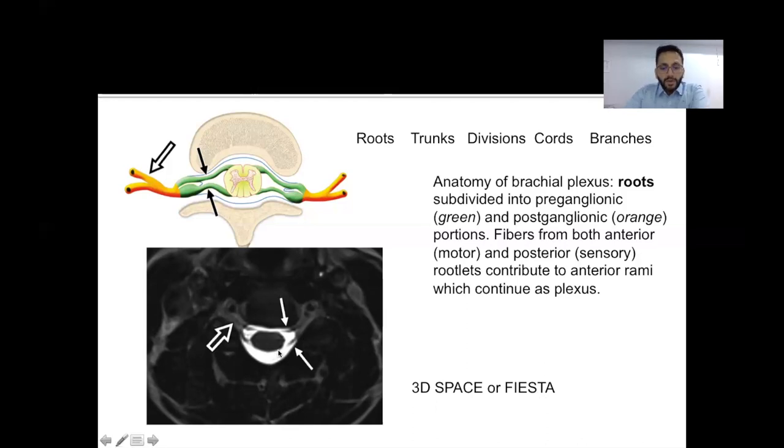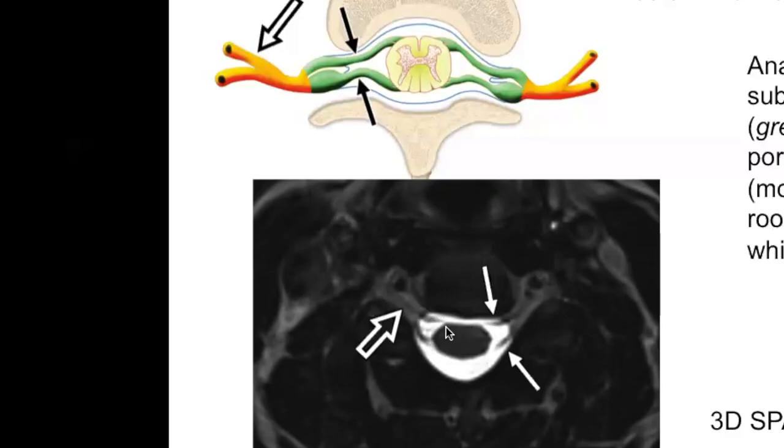So this is the image here which shows the ventral rootlet on the right side. So this is the right ventral rootlet, the posterior rootlet. These joined together to form the exiting nerve here. This nerve again will divide into the ventral ramus and the posterior ramus. In nerve root avulsion, we will see that this segment is lost and there will be a formation of a pseudomeningocele in this region. We will come to these images later.